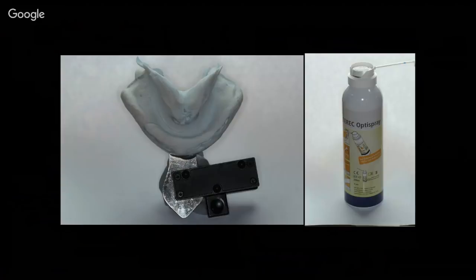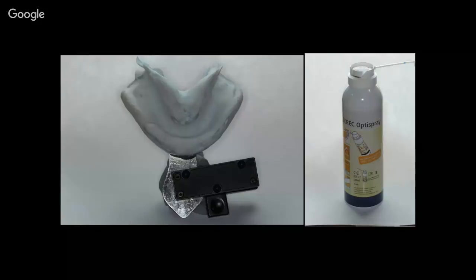Okay, somebody asked how you could add the denture version into their Blue Sky Plan. And Cory had mentioned that the links are in the Blue Sky Bio user group. So you could just go to the group and download the Blue Sky Plan version with the Denture module. It's currently a beta release, so it's a separate module from the main Blue Sky Plan install file. Yeah, it won't overwrite your existing Blue Sky Plan. So what you'll do is download that folder, unzip it, and then if you want to use this and play in the beta version, just open that unzipped folder and click on the execute file and just run it as a standalone.